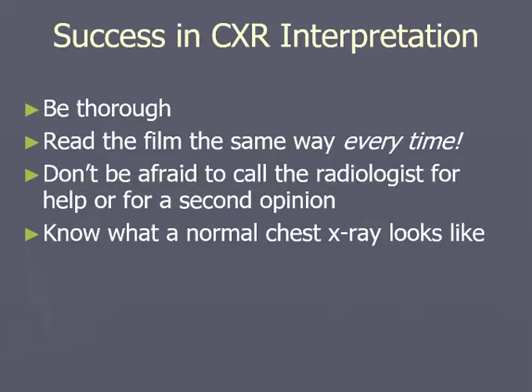And if you see something that you don't quite see or you don't quite agree with on the radiology report, don't be afraid to call the radiologists. Radiologists are lonely little people. They sit in a dark little room the entire day. They love to talk to people because they just see these films in a vacuum.